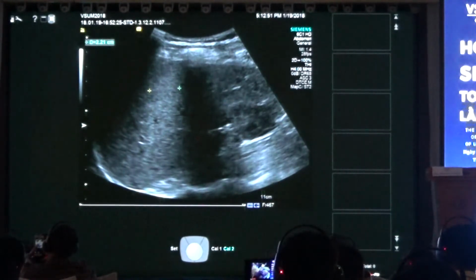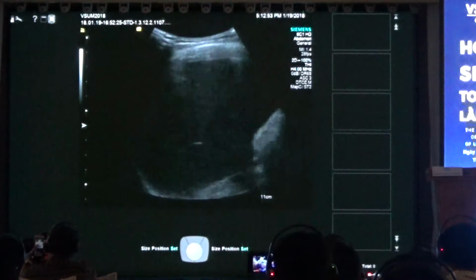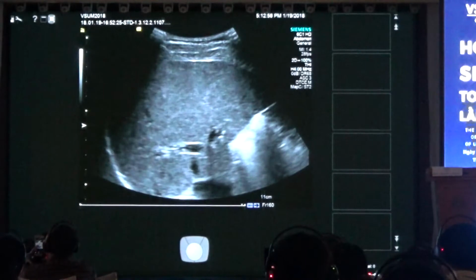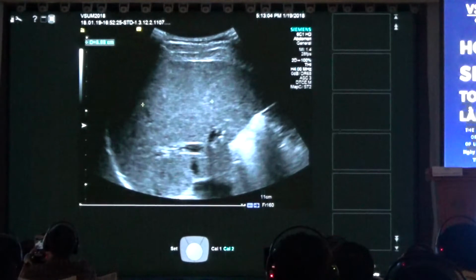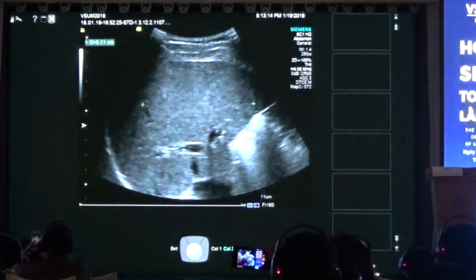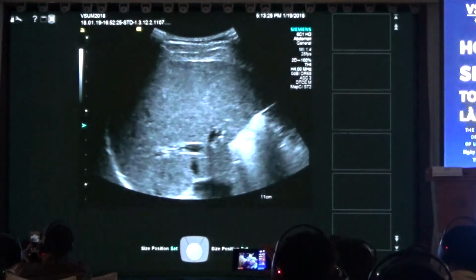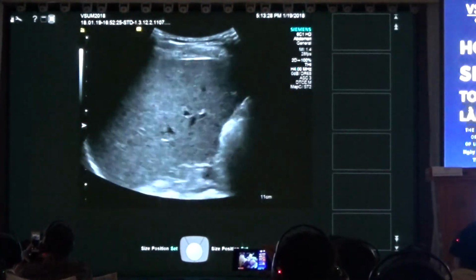Recall that our window was about 2 centimeters, and right now it looks much better. So we have no more 2 centimeters, but our window for elastography widened to more than 6, 8 centimeters. So it was much better, and even we could do better. The enemy of the good one is the better one, so I will fight a little bit for the best position of the patient.